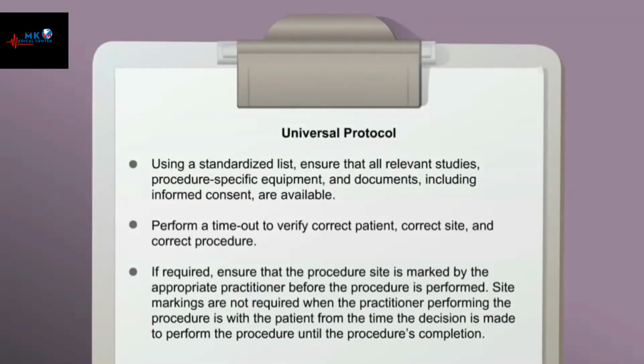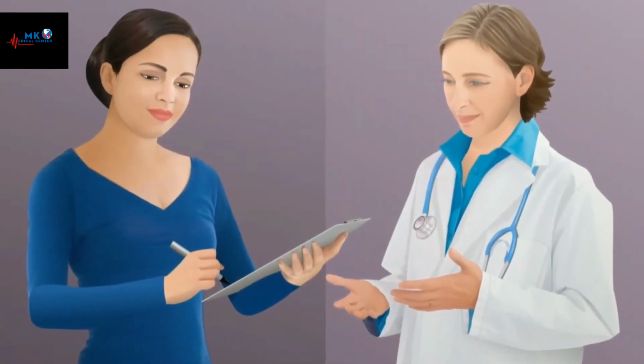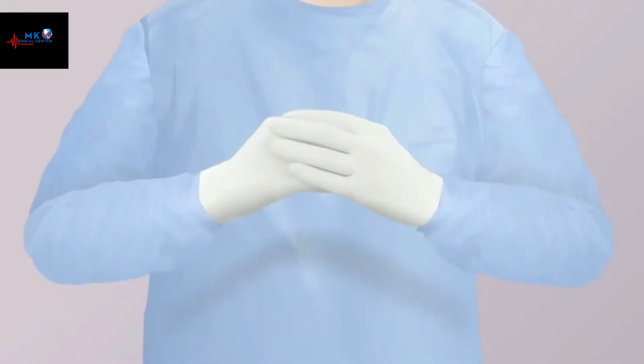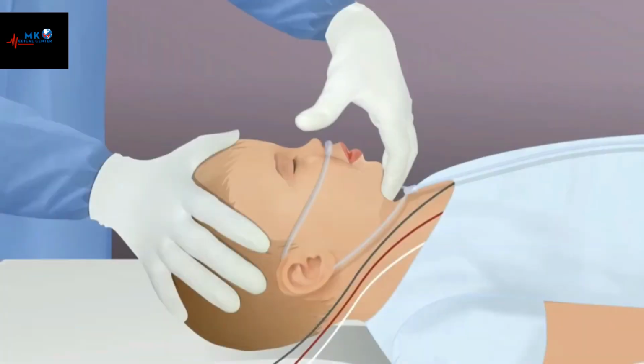If time permits, comply with universal protocol. Perform a timeout to verify correct child, correct site, and correct procedure. Perform hand hygiene and don gloves, face mask, and eye protection. Assist with positioning the child's head.